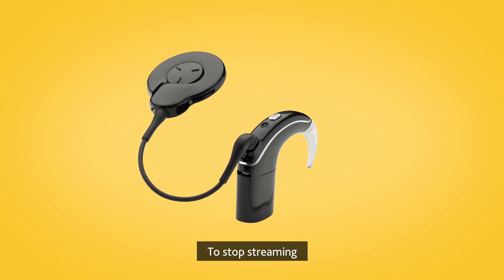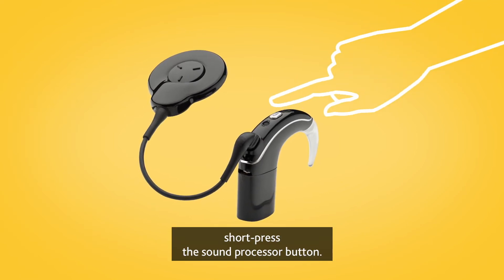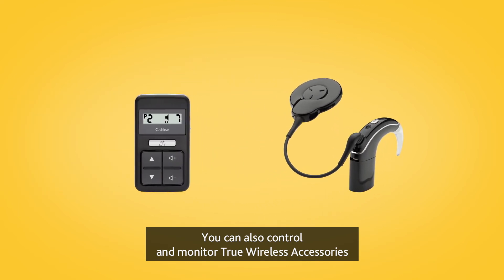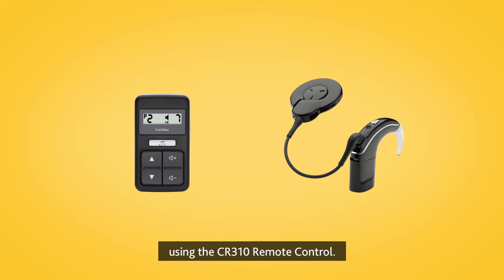To stop streaming, short press the sound processor button. You can also control and monitor True Wireless accessories using the CR310 remote control.